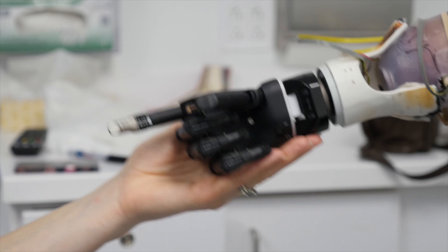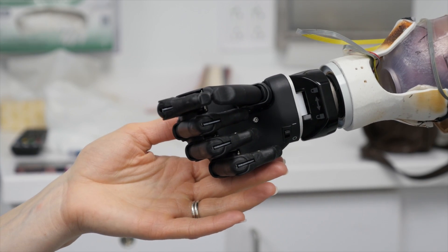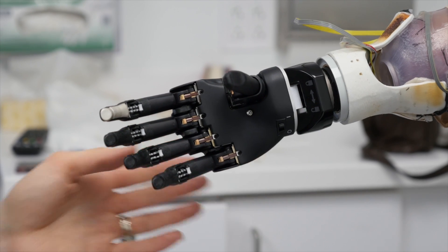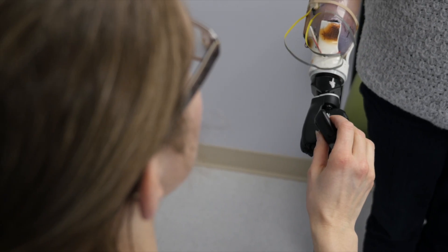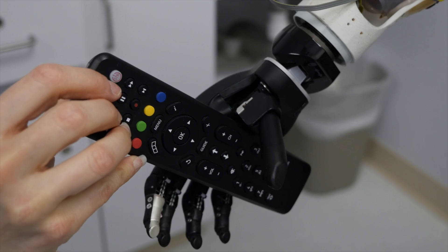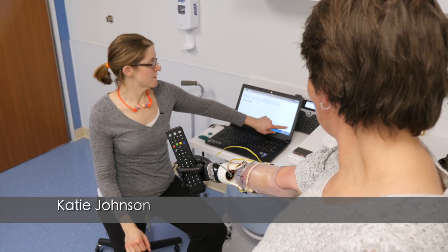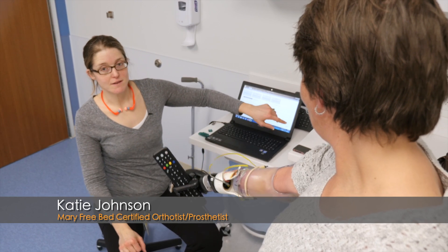Due to the nature of my job, Katie said we need to go ahead with the myoelectric one — it will be easier on your shoulder. She has just been amazing, and she knows when it gets a little overwhelming for me, she backs off and then comes back to it. These signals are really, really small — basically no signals — just showing that she's able to relax her muscles completely. Physical therapy, just amazing. They're trying so hard to get you to be independent, which is a big part of it. You feel so lost.